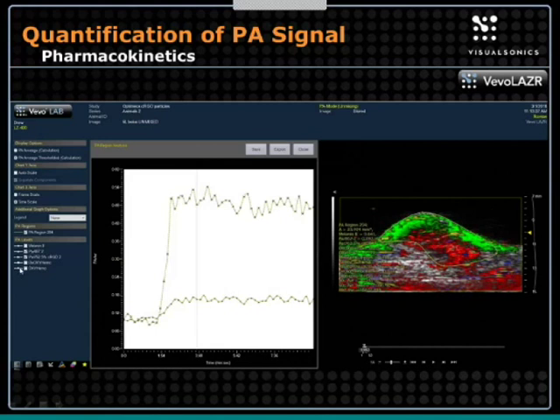There's a whole bunch of really nice graphing features, which I actually don't have time to get into all of them, but a whole bunch of really nice graphing features which have been implemented in the new software. And one of them is to be able to customize the lines that you're using here and markers, but also which agents you're actually looking at. We're looking on the time scale now.